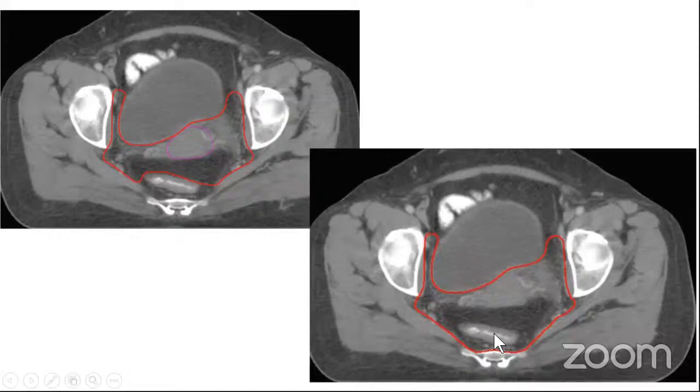That's practically very difficult, to reduce the doses in such a volume. So stage 3B is one area, or whenever there is direct involvement of the uterosacral ligament with evidence from MRI, in that scenario also we'll have to include the rectum into the overall PTV volume. So this is one special case where you'll have to include the rectum into the overall volumes.